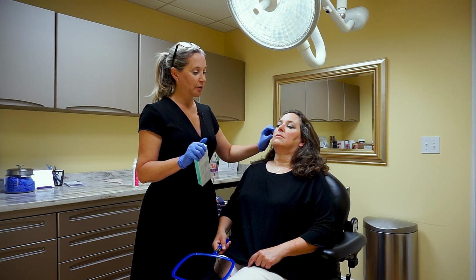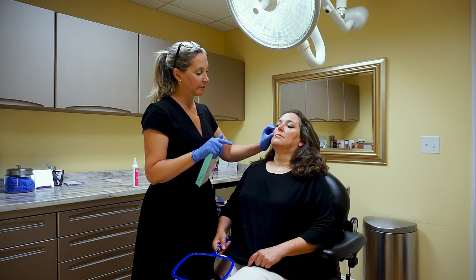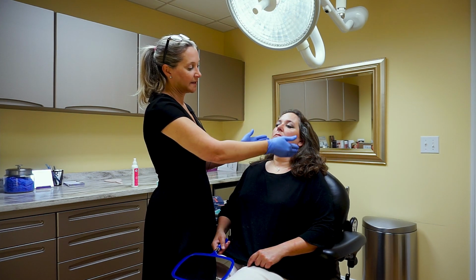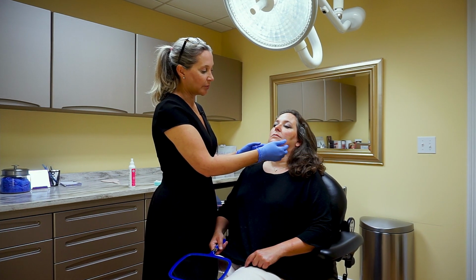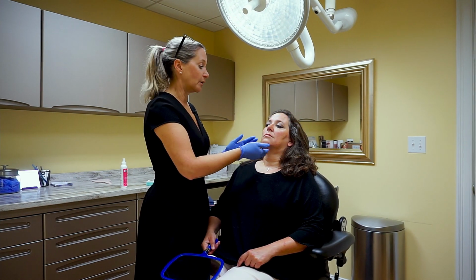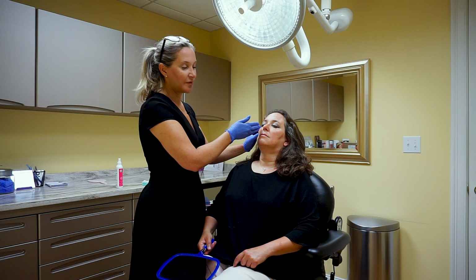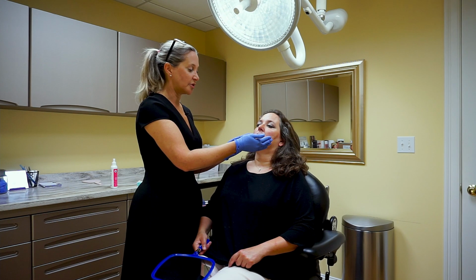The beautiful normal of cheek volume would be to have more volume out laterally, so that when you look at her face, it's going to angle in this way. What we don't want is a squared off face. So I'm not someone who does a lot of injection into the pre-jowl. I'll do a little bit, but what I really want is to give the effect of angling the face. If I give a little bit of volume out to the lateral cheek and then come in after that and feather in some lighter filler, we're going to get a rounded curve to the cheek that restores youth.